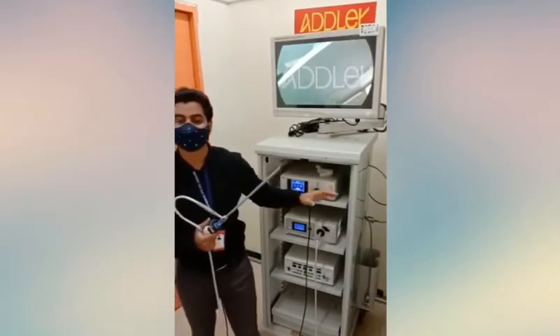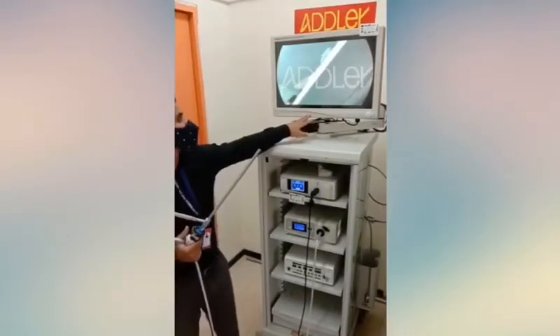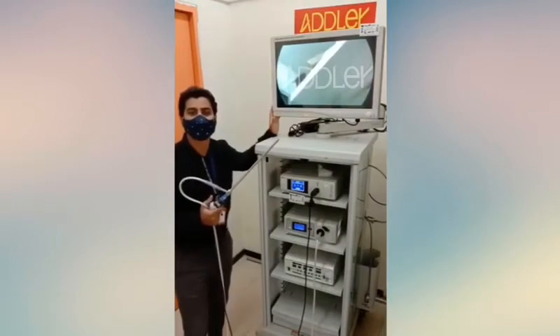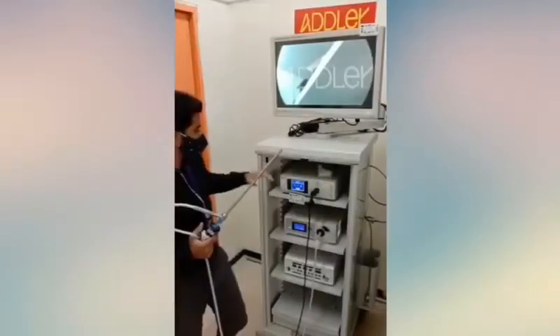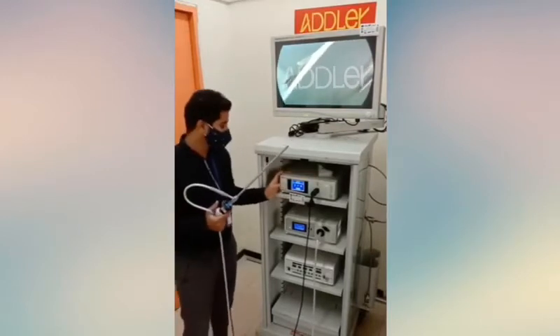Welcome to Adler's Demo on the Stryker 1288 System. We're using the Stryker Vision Elect monitor with an HD display of 1080p and a frequency of 60 Hz per second. The console we're using here is the 1288 Full HD console with full touch screen controls.